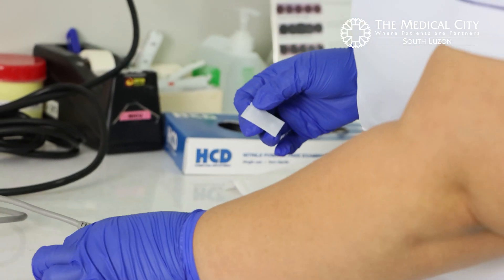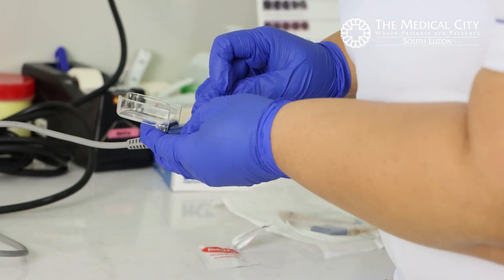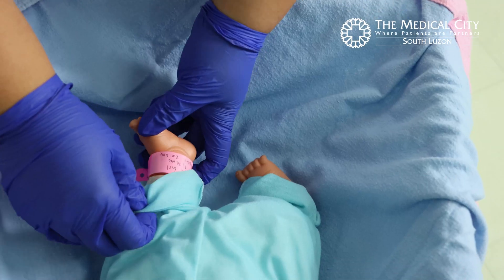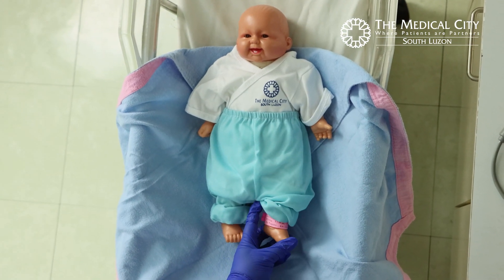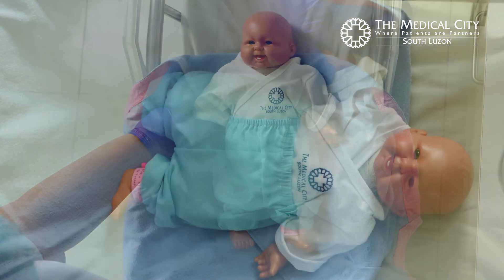Make sure the pulse oximeter probe and the cable are clean. Check the patient's band to make sure you have the correct patient and that they are at least 24 hours old. Make sure the patient is calm and warm but not in a deep sleep.